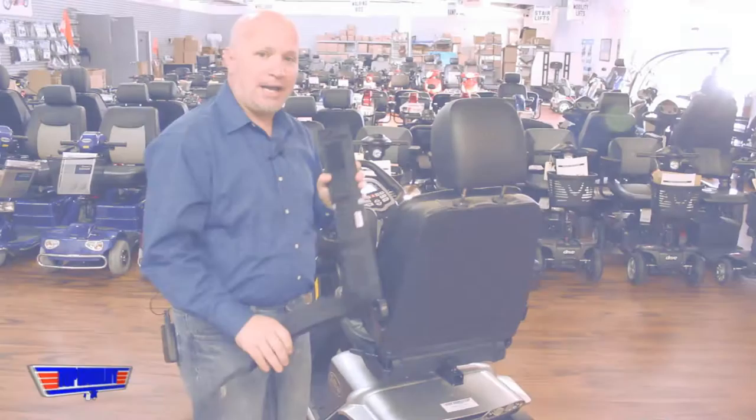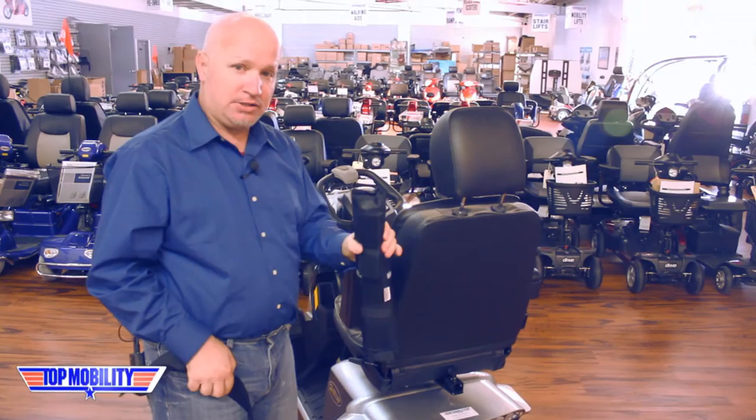Introducing model JCH-10 Challenger Cane Holder. Upon unpackaging your model JCH-10 Challenger Cane Holder, you'll notice you have your cane tube as well as your strap.